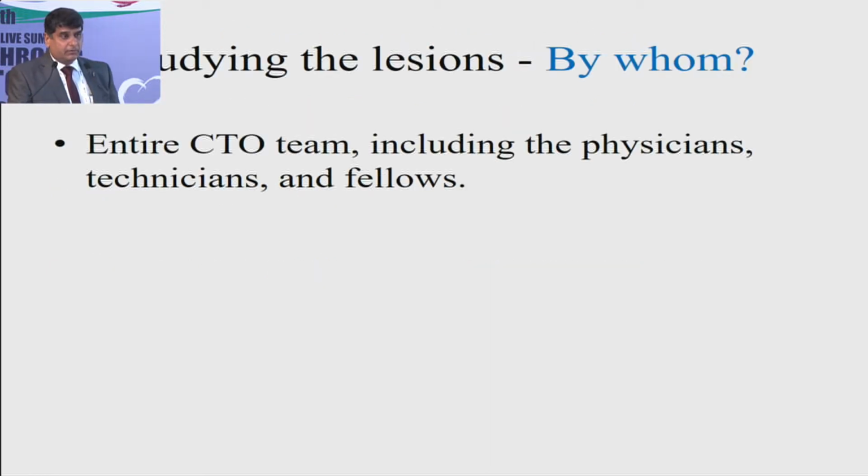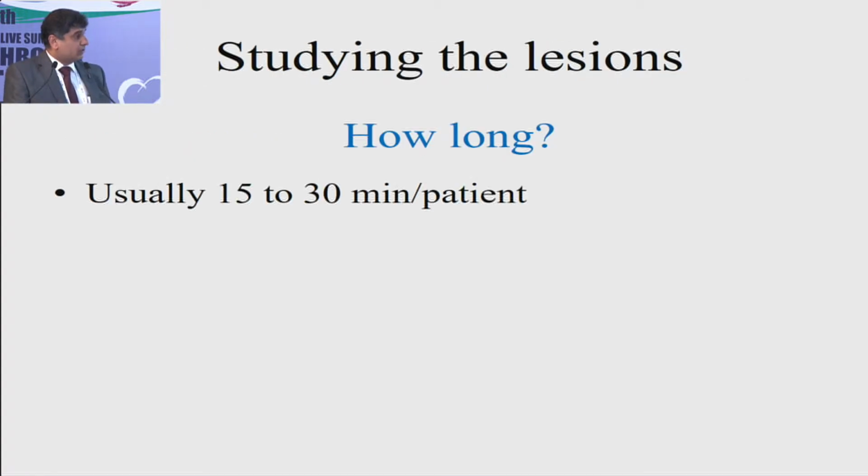And obviously CTO is always teamwork. The entire team has to go through the CTO angiogram, including the physicians, technicians, and fellows, and we should try and get in as much input as possible from the team so that we have a strategic plan. There is no fixed time as to how long one should look at an angiogram, but once the assessment is complete, we should all have a set plan as to how we are going to proceed and strategize as we go along.